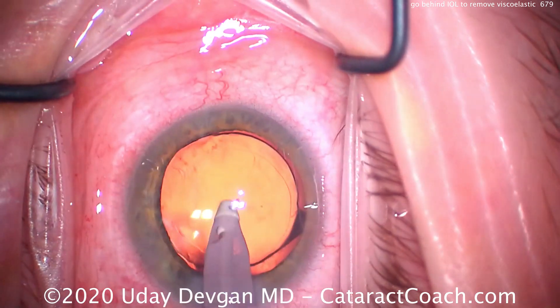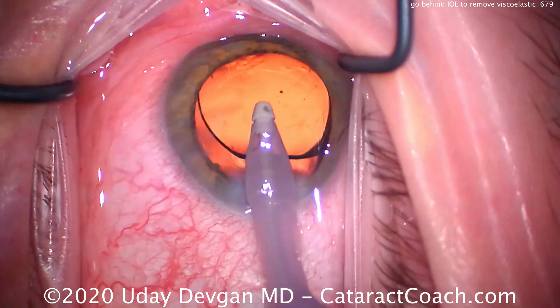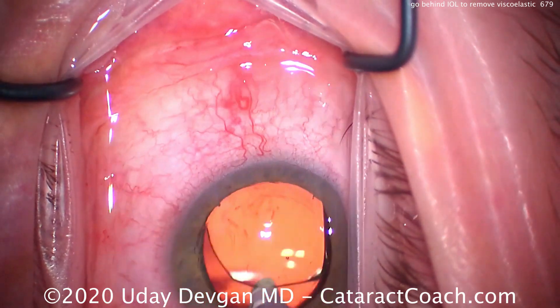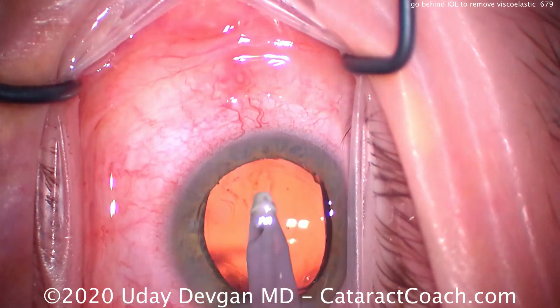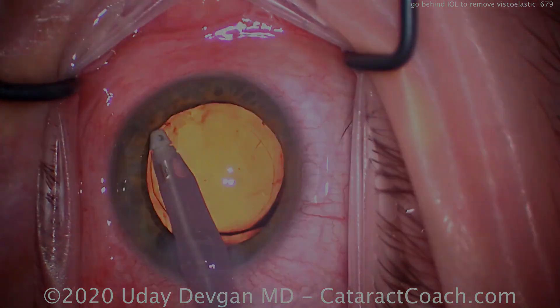My opinion is: if you're just starting out in your first 100 cases, don't worry too much about it — you're probably just doing monofocal IOLs anyway. But certainly you do need to progress to the point where you are going behind the IOL to fully remove the viscoelastic. It will give your patients the best results.